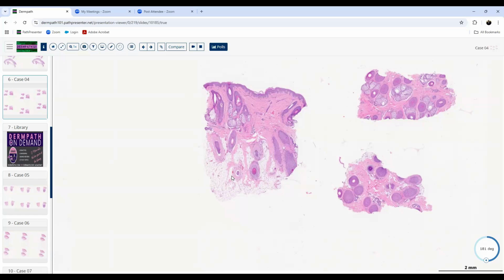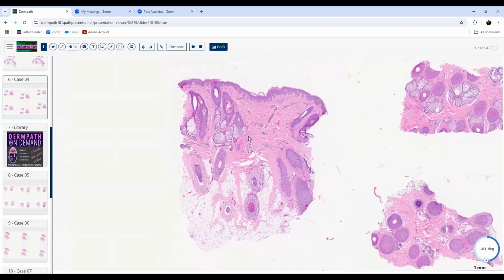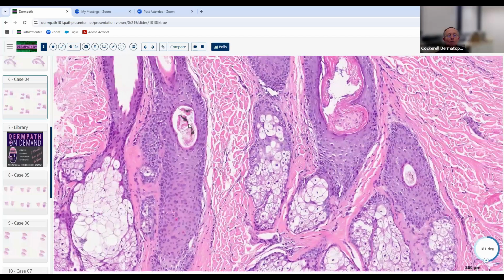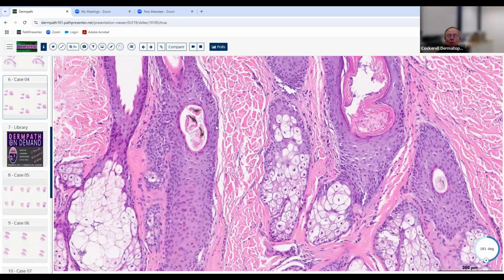And if you zoom in, we can actually see pigmented casts. Given the lack of inflammation, this points us to a trichotillomania. Very good. Excellent. Trichotillomania. So that's virtually pathognomonic. When you see this, it is pathognomonic. It means that they've been twisting and pulling their hair shafts. So they got trichomalacia. The fact that you identified that, that's good.